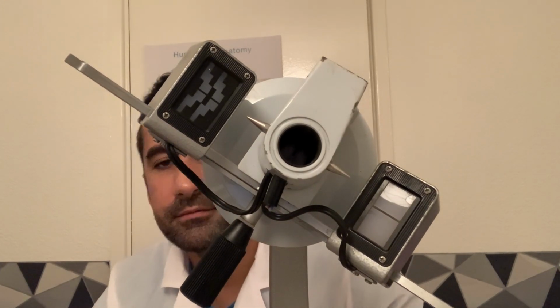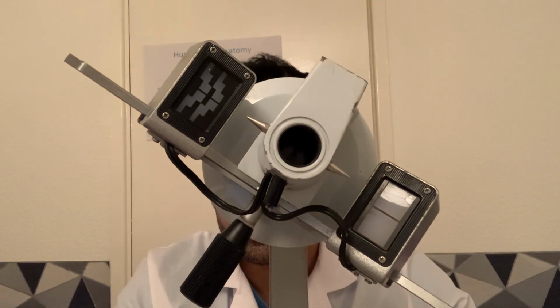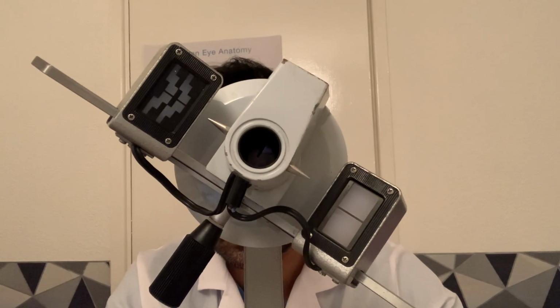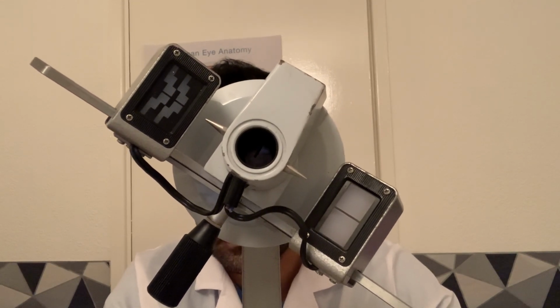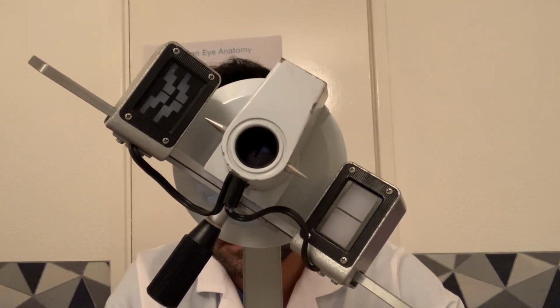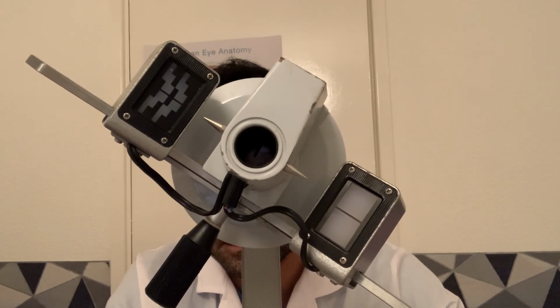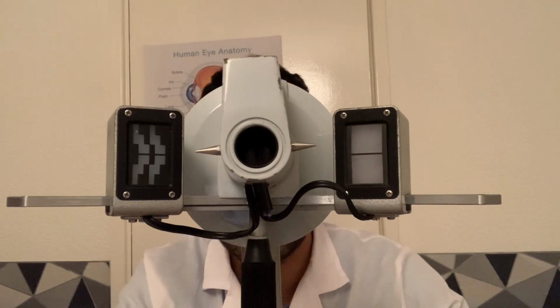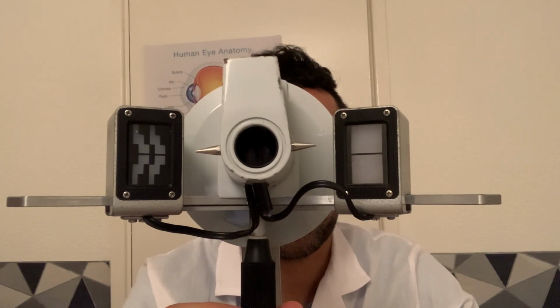Let's move on to the left eye now. Okay. And we'll obtain the correct distance from you. Excellent. Okay. Keep looking into the distance straight ahead now.